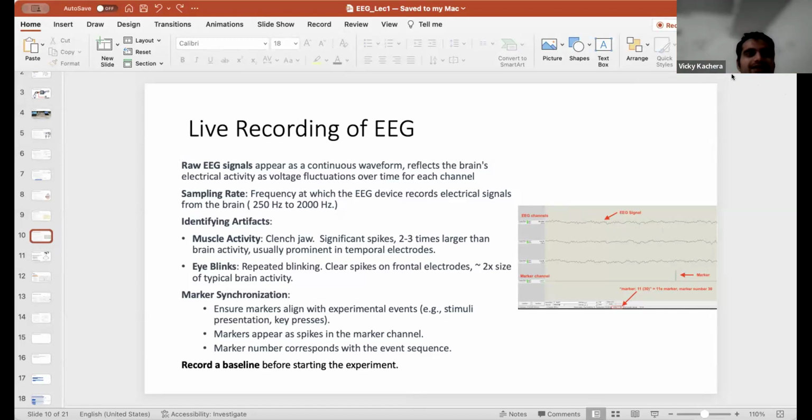They recorded their EEG data for 90 minutes, just lying quietly in Shavasana. After that, in the second visit, the participants were randomized into two groups. The first group practiced 30 minutes of Yog Nidra, and the remaining 60 minutes, because 30 plus 60 equals 90, they lay quietly in Shavasana. The other control group did the same Shavasana for the full 90 minutes.